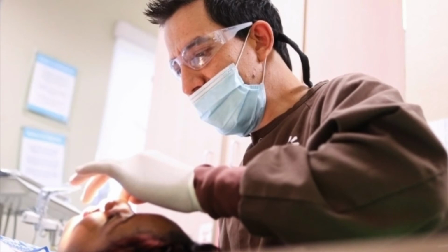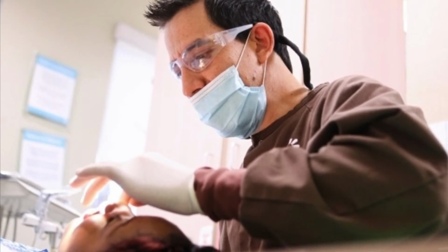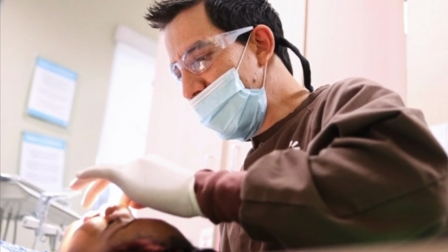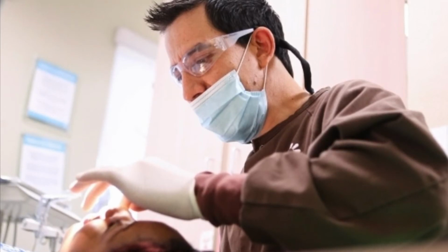Some people ask me how the bisecting technique is not accurate. It is because the X-ray beam is not perpendicular to the tooth, and the film is not parallel to the tooth. This was my answer. The bisecting technique cannot be reliable.